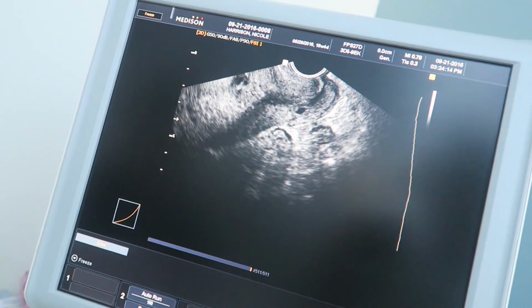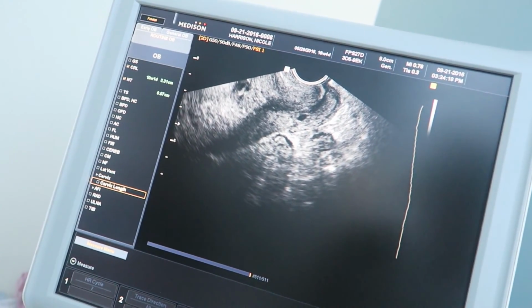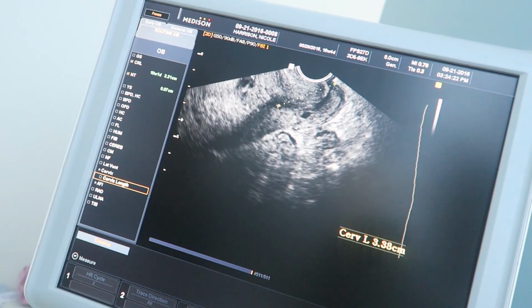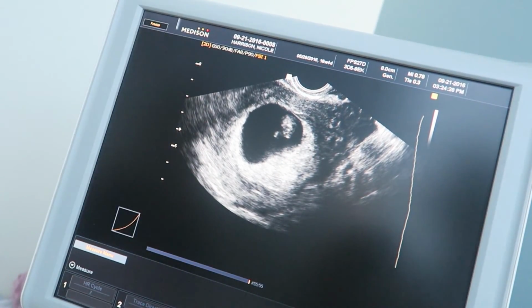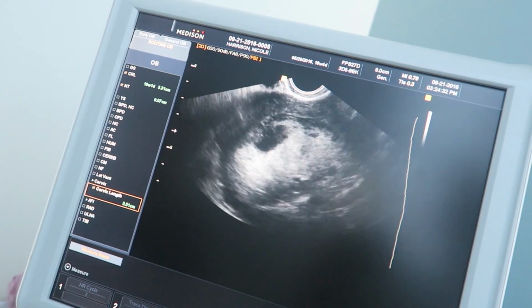Just one sibling for Brendan. And right? I just checked the corners. There's just only one. He wants to. That's okay. Daddy's okay with that. What I'm going to measure here is the length of your cervix to show that your cervix is long and closed, and that the implantation of the sac is exactly where it's supposed to be, which is up in the top of your uterus.